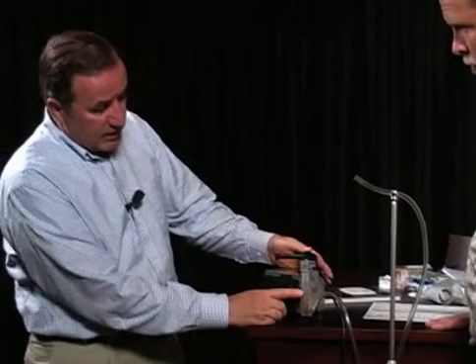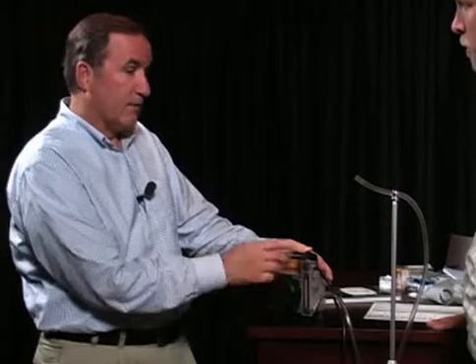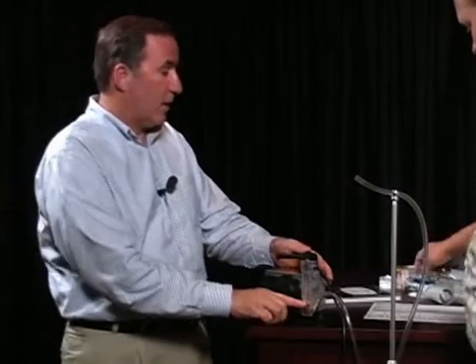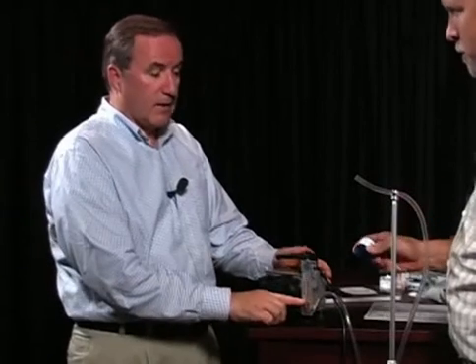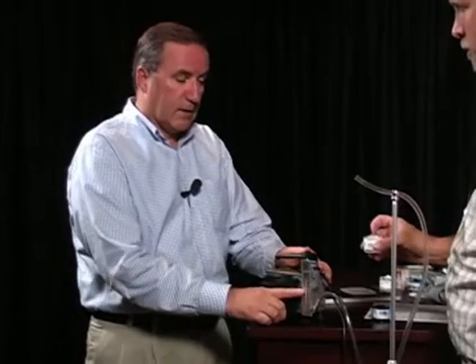Then when you use your pump, it's pre-calibrated, and you've got a rotometer here, and when you turn it on, you want to make sure it comes to the proper flow rate each time. For instance, if you're going to use a Micro 5 or a Z5, you're going to want to use 5 liters a minute. If you're going to use an Aerocell, you're going to use 15 liters a minute. So it's very, very important.